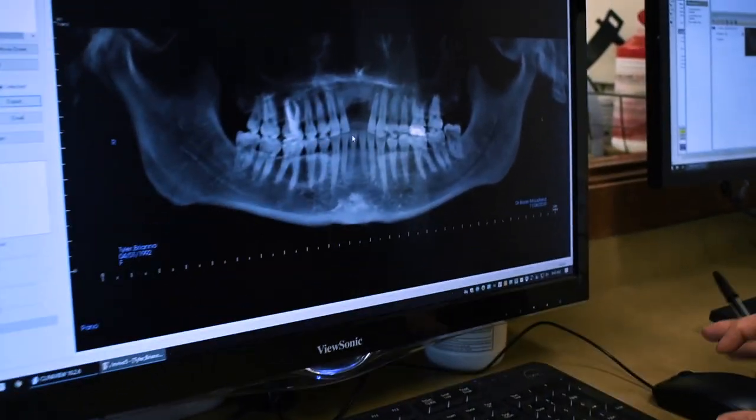Today we're going to look at a young lady that was in a car accident when she was seven years of age and she lost her two front teeth. Today what we're going to do is take some wisdom teeth out, place some implants, and do some bone grafting in this area. Let's take a look at the x-ray together and I'll walk you through what I see.